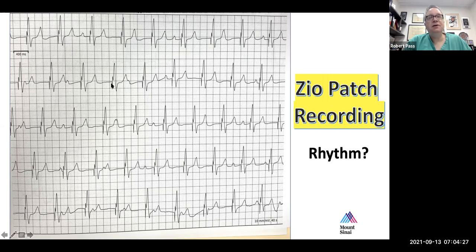When you're in sinus rhythm and you have WPW, you are correct that there is a delta wave, but what is the delta wave connecting? What precedes and what follows the delta wave when you're looking at someone with WPW in sinus rhythm? What immediately comes before the delta wave and what is the delta wave followed by?